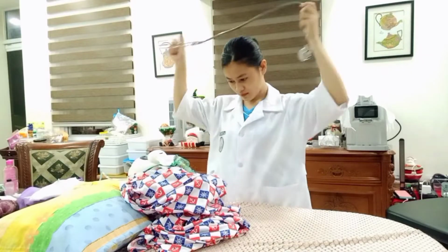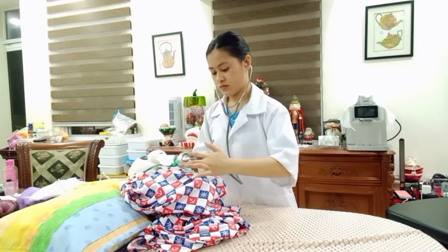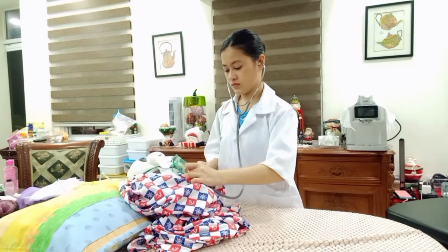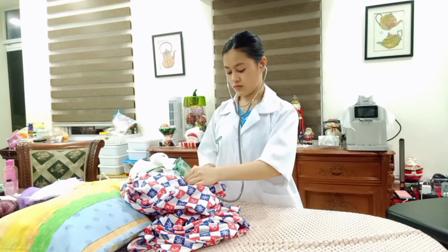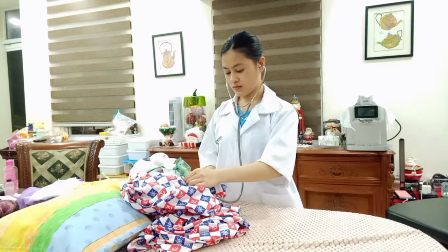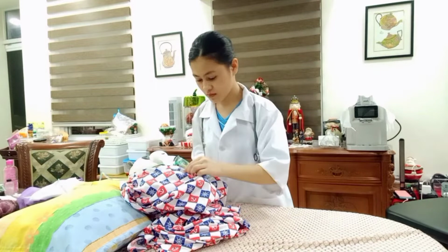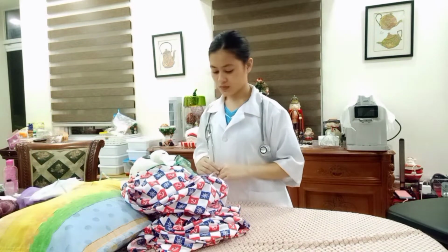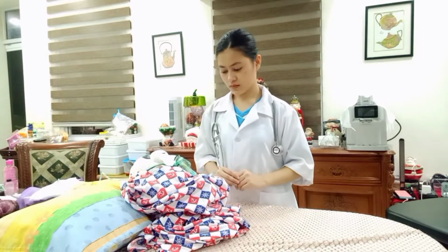For the assessment, assess the patient's respiratory status including respiratory rate, depth and rhythm, breath sounds, color, and pulse oximeter results. For the rationale, it helps determine whether the patient can tolerate tracheostomy care. Next is to assess the tracheostomy site for drainage, redness, or swelling. So for the rationale, drainage, redness, or swelling may indicate infections.